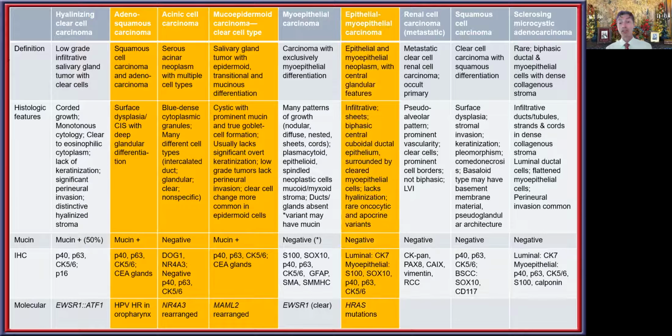In an area like this, where you have dense sclerotic hyalinization with an inflammatory infiltrate, now you're able to see a much more well-developed mucocytic differentiation along with the intermediate cells, but still the prominent finding of clear cells is easily noted in this field. When you look at the immuno, the tumor cells here are positive with P63. There is an internal control with the overlying surface, and CK5/6 is strongly positive as well in the neoplastic cells.